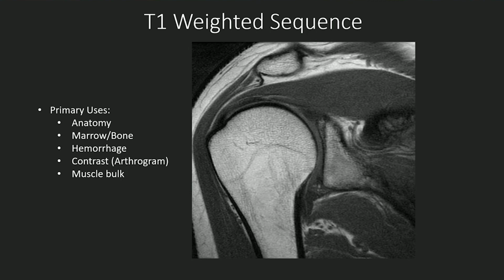Sure. So, when we look at MRI, we have to suss out why we use MRI as the workhorse of musculoskeletal imaging. And the primary reason is the ability of MRI to create soft tissue contrast. What I mean by that is, soft tissue contrast is the ability to tell two different substances apart when they're directly next to each other in an image. If you think of X-ray, when you look at the soft tissues on X-ray, you can tell where muscle is. Sometimes you can't really tell where subcutaneous fat starts and ends, because they're similar in color. Bones stand out because they're a totally different color.